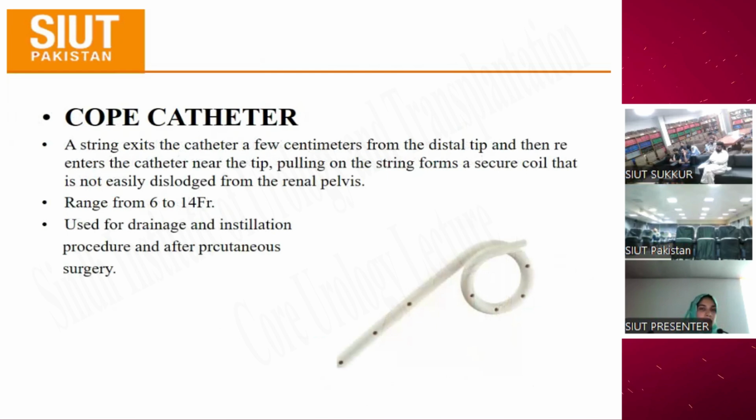So you see, if we just think that this is a piece of a DJ stent and not a piece of a PCN, then there are side holes, and also there are markings over it, which are not seen in this picture. So what happens is these side holes are actually those areas where, if you see microscopically in a model, when a DJ is in the system, there is a lot of turbulence at these points, which are smaller holes on the sides. And these turbulent flows lead to kind of tornadoes.